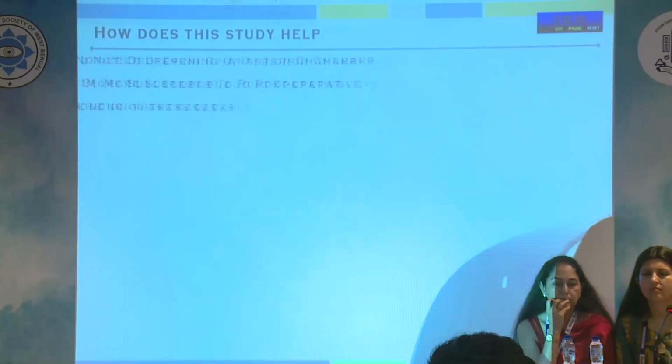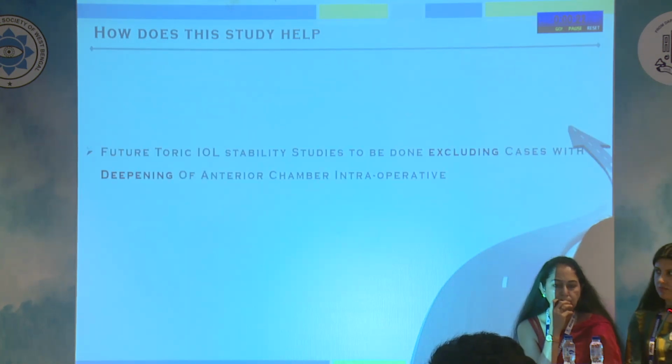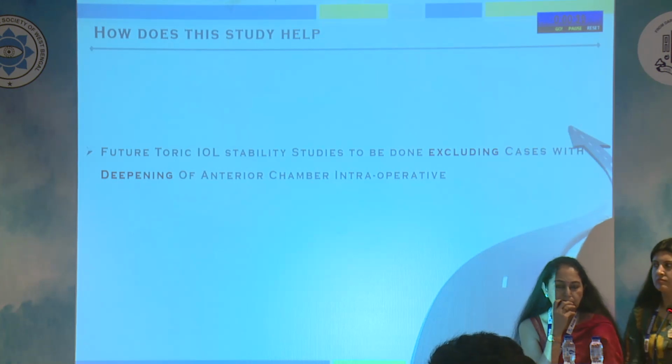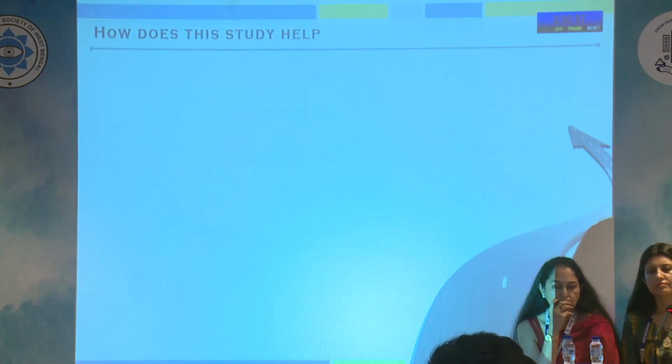So how does this study guide us further? So one, we should exercise more caution if we notice any sudden deepening of anterior chamber. While conducting this study, we noticed that in sudden deepening, these patients are more prone to IOL rotation in the post-op 1 hour period. Further toric IOL stability studies need to be done, but if there is a deepening of anterior chamber noticed in any cases, those patients should be excluded from the study as they can skew your data.